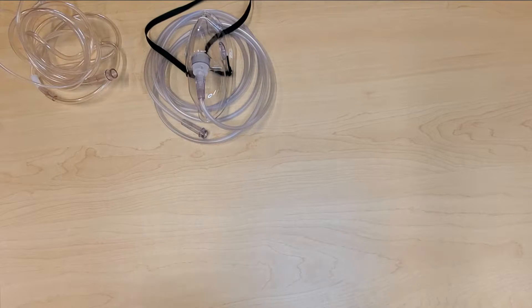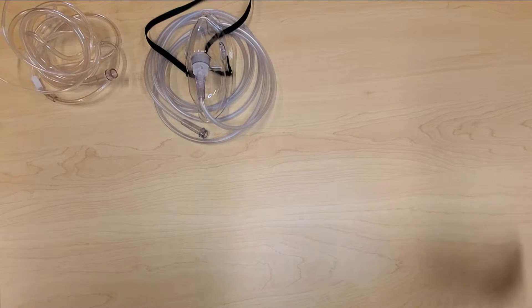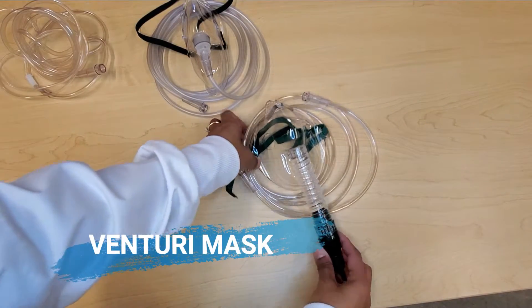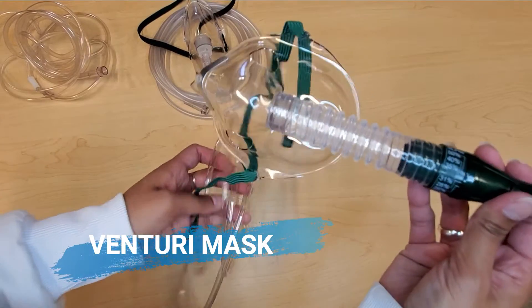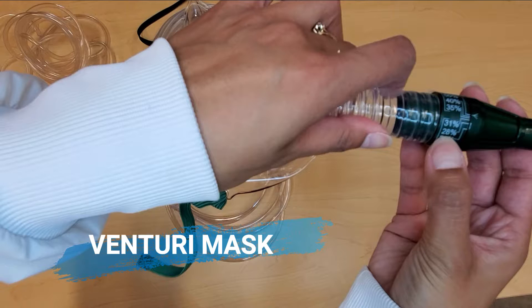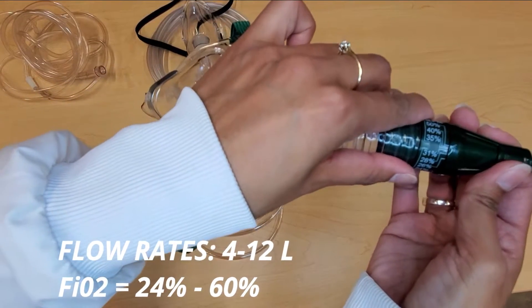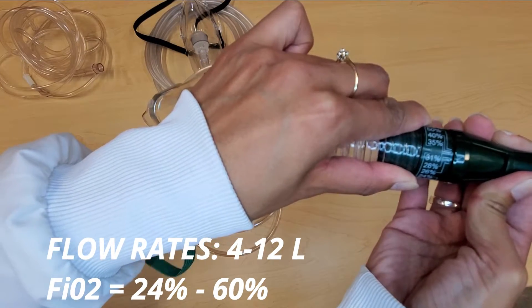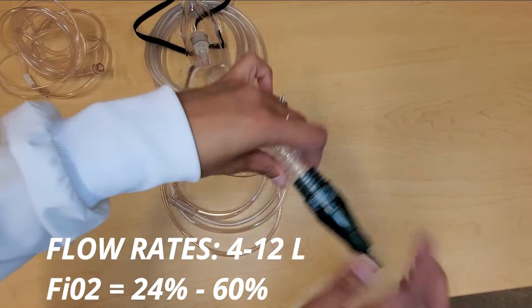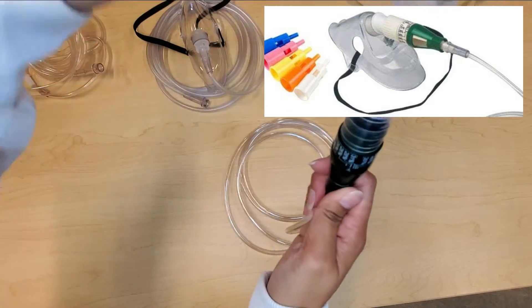Now let's say our patient's saturation level is still not stable with the simple face mask. We now get an order for a venturi mask. With a venturi mask we're able to set a fixed flow rate so we can precisely give a patient the exact FiO2 that is desired. It's either a dial that we set to the correct FiO2 percentage, or there are different colored adapters where each adapter has the desired FiO2 level.